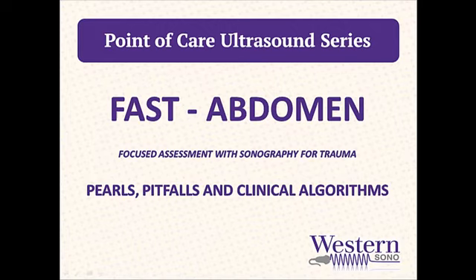So this concludes our introduction to point-of-care scanning techniques of the abdominal FAST exam. Be sure to review the next screencast in this series, where we will review the clinical applications, pearls, and pitfalls of this study. You can find all of these resources at westernsono.ca.